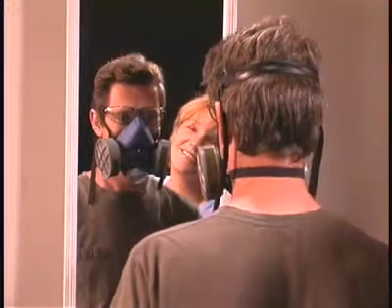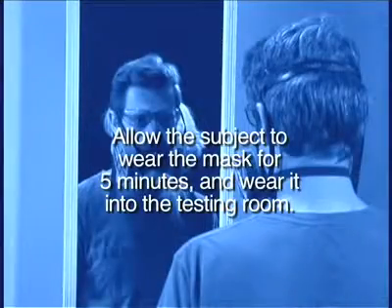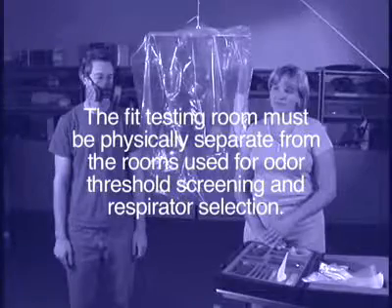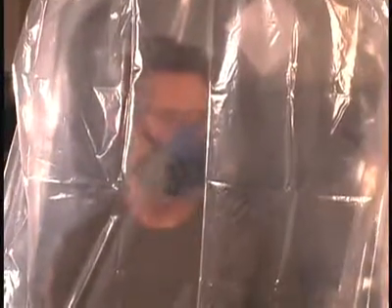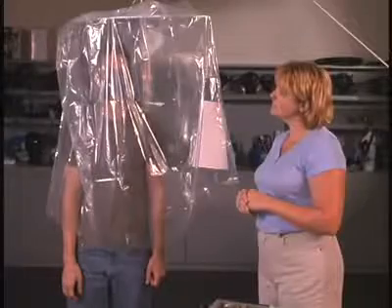After conducting fit checks, the subject is ready for fit testing. Allow the subject to wear the mask for at least 5 minutes before beginning the fit test and wear it into the testing room. The fit testing room must be physically separate from the rooms used for odor threshold screening and respirator selection. OSHA regulations require that the fit test chamber be similar to a clear 55-gallon drum liner inverted over a 2-foot diameter frame, situated so that the top of the chamber is about 6 inches above the test subject's head.